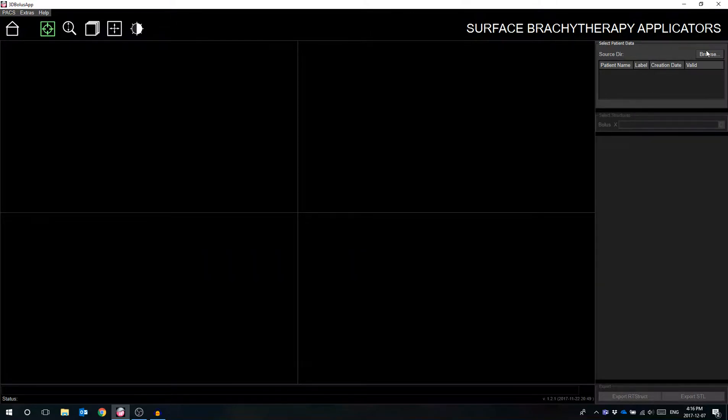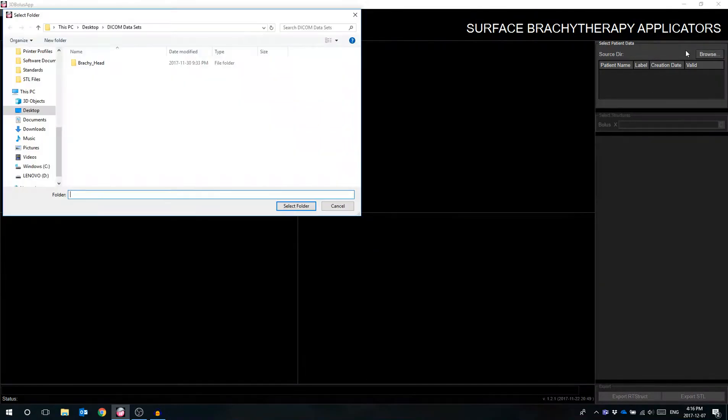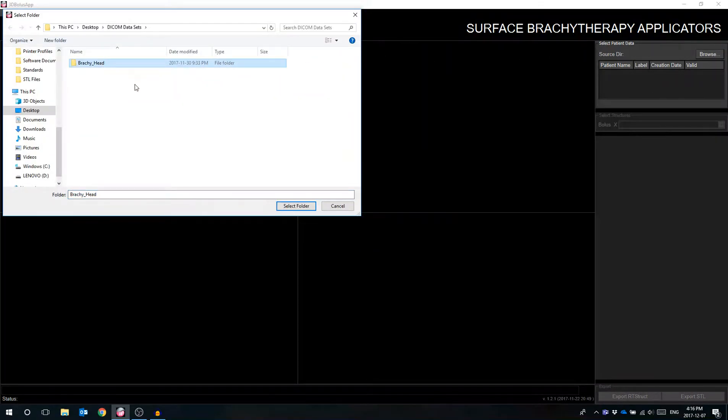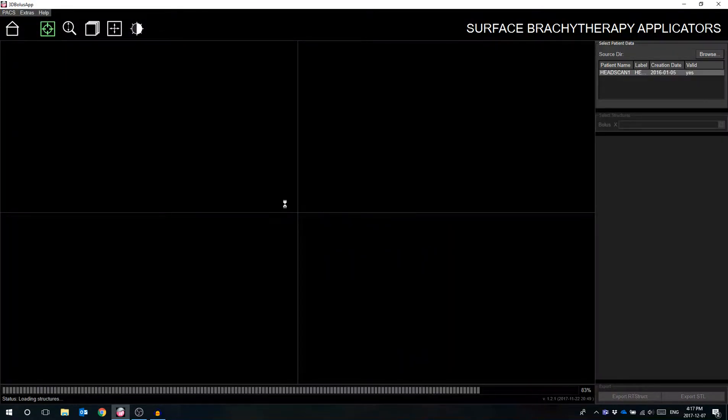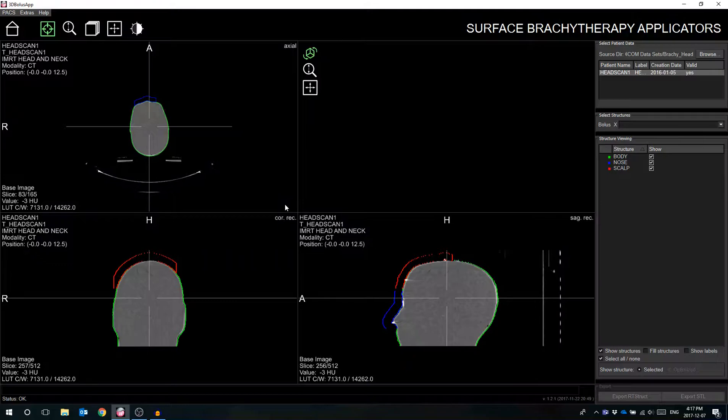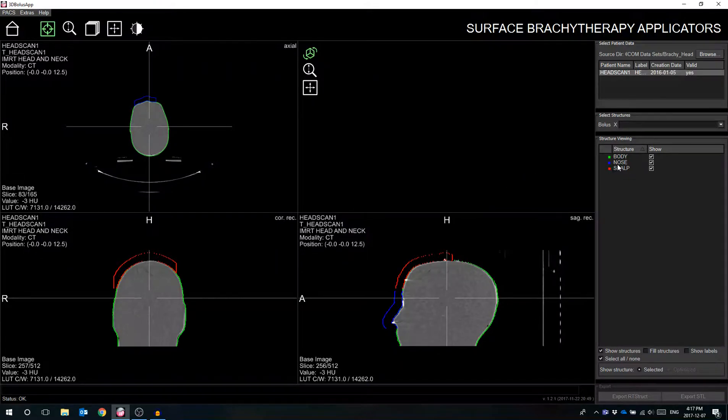By selecting the browse button, the user can select the patient's directory which houses the necessary DICOM information, including the patient's CT images and structure set coming from the Brachytherapy treatment planning system.